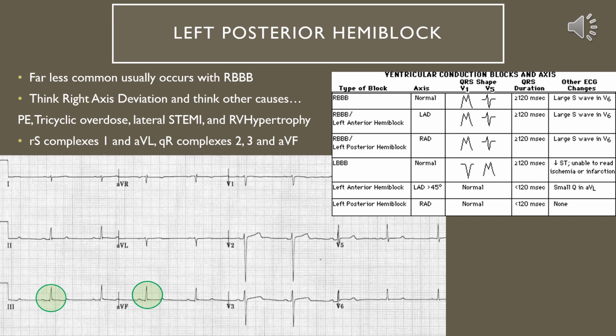Okay, in the next lecture, we're going to talk about different arrhythmias, starting more with lethal arrhythmias, and we're going to do some practice. You should be able to print out the EKG slides that we're going to use for lecture 2. That way, as you're going along the slides, we can look at them together and you can write on them and practice.